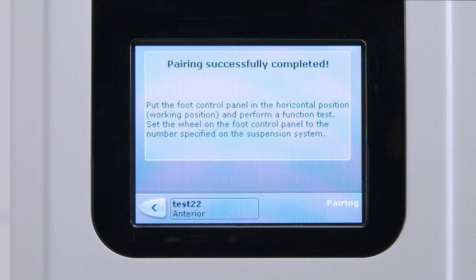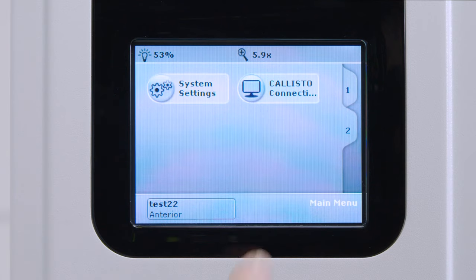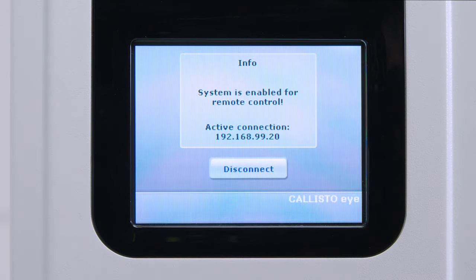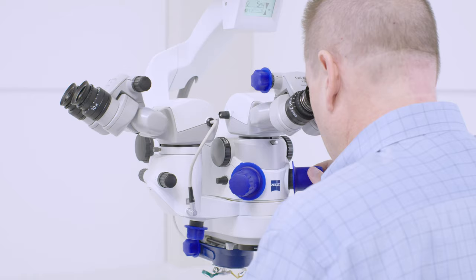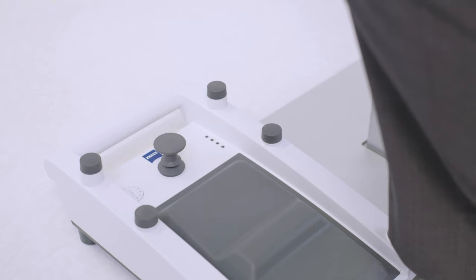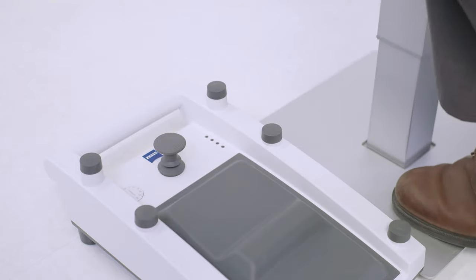When successfully paired, place the foot control panel on the floor near the microscope head. For Artevo, ReScan, and Callisto Eye systems, from the main touch screen press the back arrow button twice and then Callisto Connection and Allow. Reach up to the microscope head and use the hand grips to release the brakes. Pull the microscope down to its working position. As a final step, check the communication between the Wireless Foot Control Panel and the microscope.